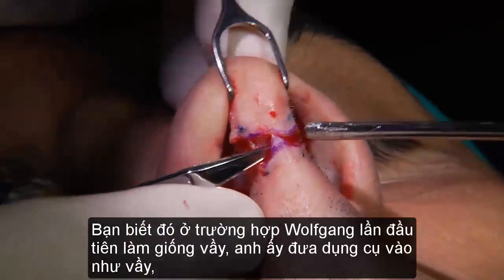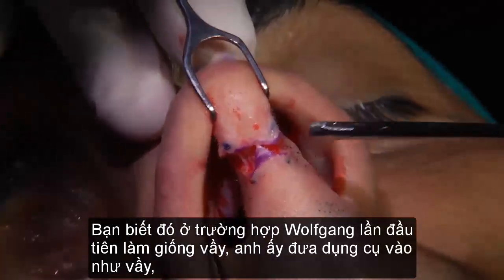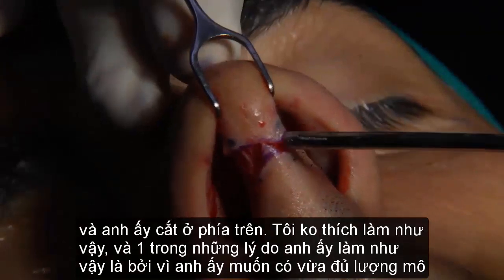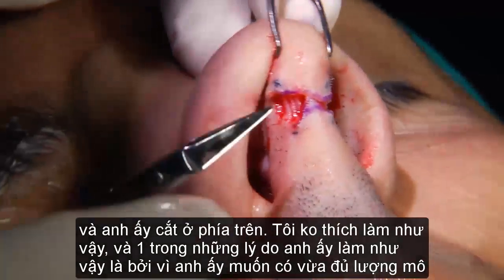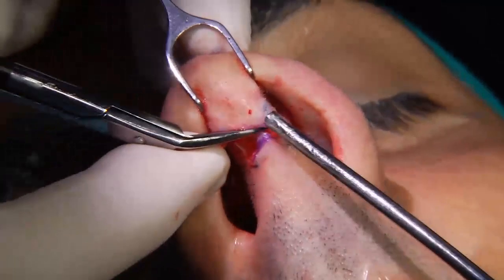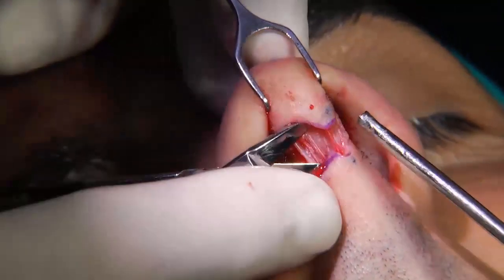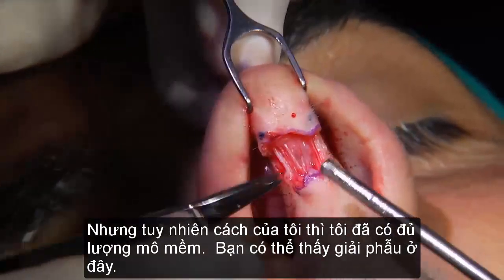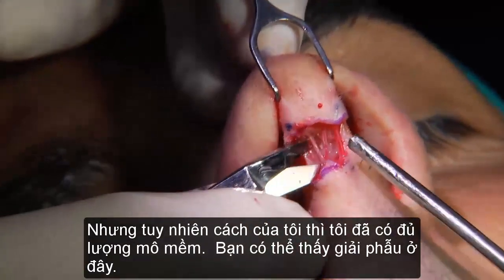So for instance, Wolfgang first does this, then he puts an instrument here, and he cuts on top. I don't like this. One of the reasons he does it is that he wants enough soft tissue, but the way I do it, I have enough soft tissue anyway. Now you can see his anatomy here.